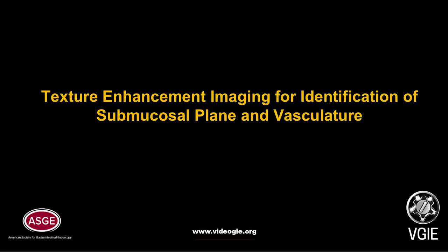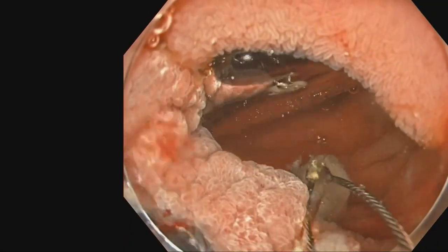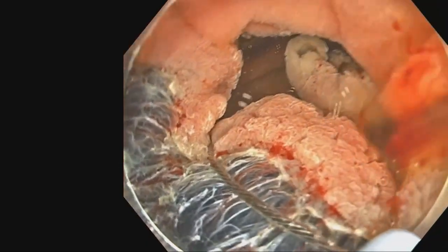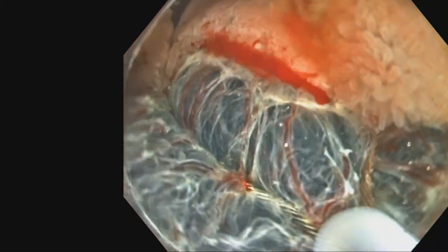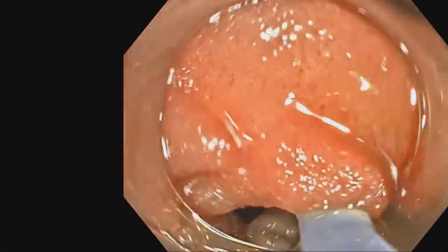In the following segment, we demonstrate the utility of texture and color enhancement imaging for identification of structures during endoscopic resection. Here's an example on the use of texture enhancement imaging during endoscopic mucosal resection of a duodenal polyp. The digitally enhanced image improves the delineation of all structures, including the lifted submucosal space and blood vessels. Importantly, the stark contrast of the normal mucosa and adenomatous tissue aids in the accurate placement of the snare during piecemeal resection.